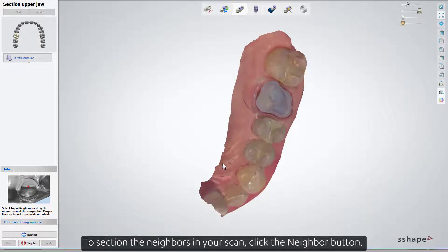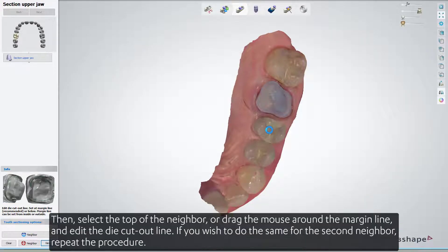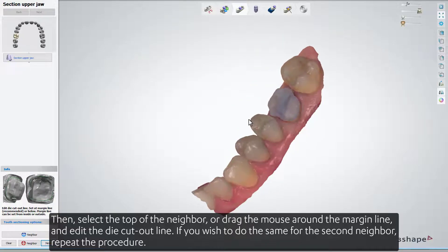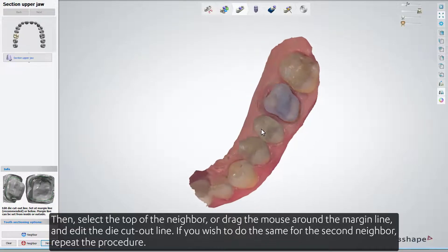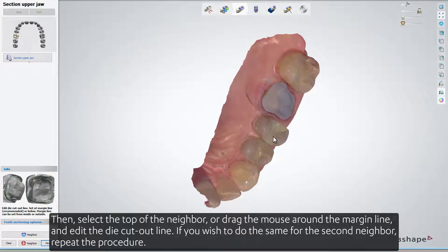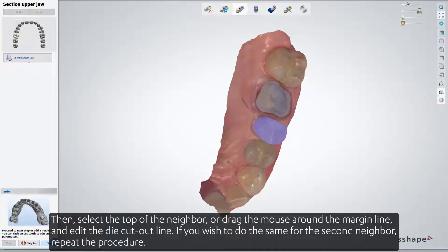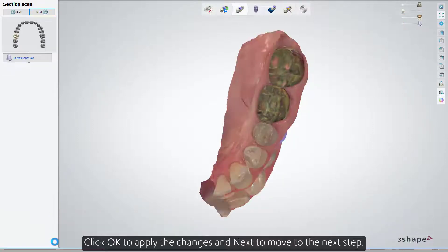To section the neighbors in your scan, click the Neighbor button. Then select the top of the neighbor, or drag the mouse around the margin line, and edit the die cutout line. If you wish to do the same for the second neighbor, repeat the procedure. Click OK to apply the changes, and Next to move to the next step.